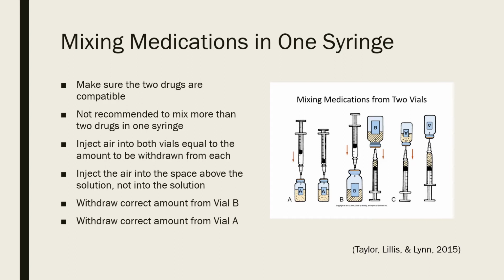So then you're going to inject the air into the first vial, and into the space above the solution, not the solution, because that could cause you to inadvertently draw up some medication that you don't need.